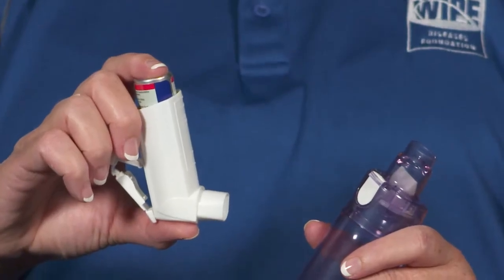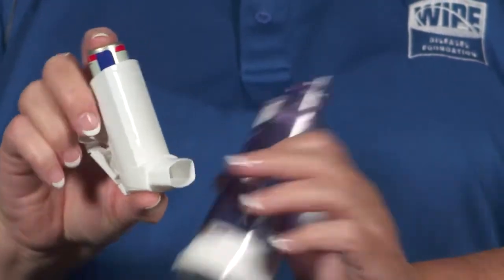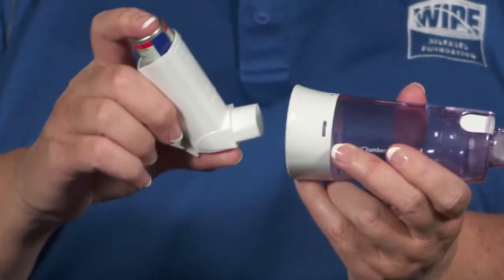Now you're going to shake the MDI for at least 5 seconds, like 1 Mississippi, 2 Mississippi, 3 Mississippi, 4 Mississippi, and so on. Sit up nice and tall with your head straight. You don't want your head down while taking this medicine because the medicine can't reach deep into your lungs if your head is down. Hold the MDI up and put the open part of the MDI into the rubber end of the spacer.